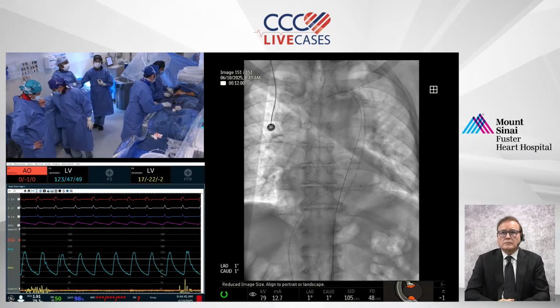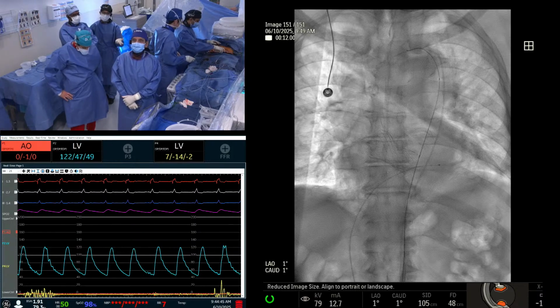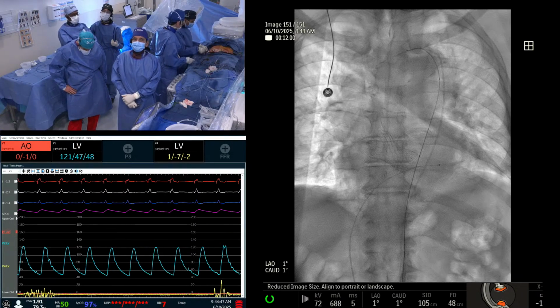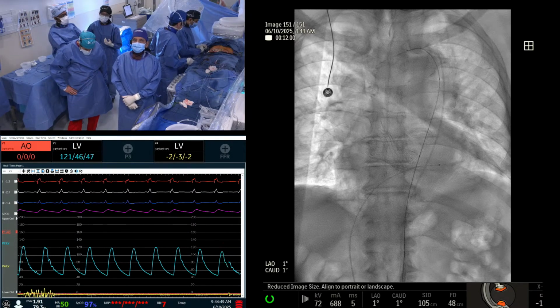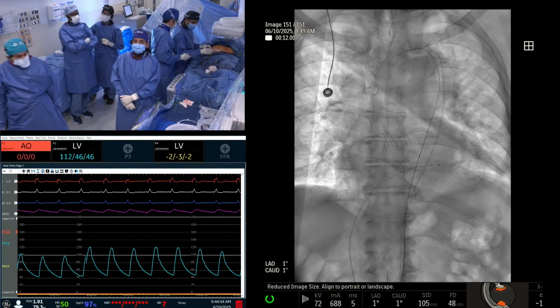So basically, here, because the mechanism is PVL, not stenosis, you would do a CT scan to look at the sizing, but you would tend to upsize to a 26 here for the second valve for PVL, not for stenosis or prosthetic regurgitation.